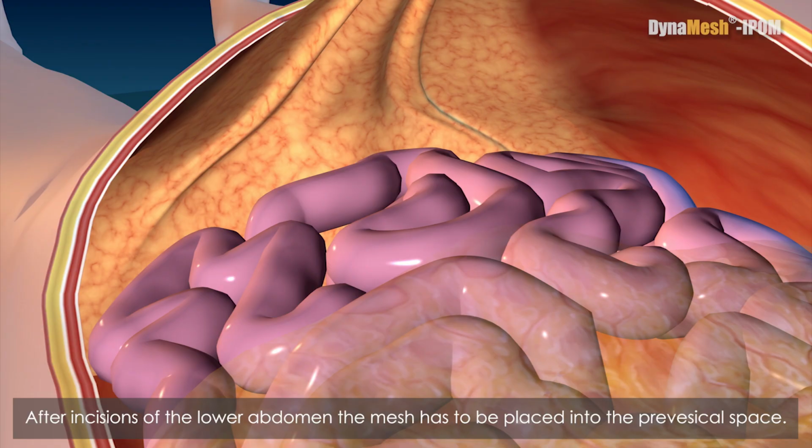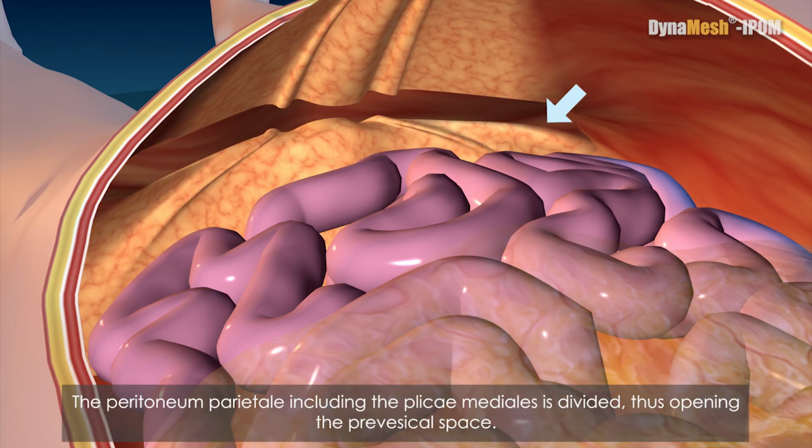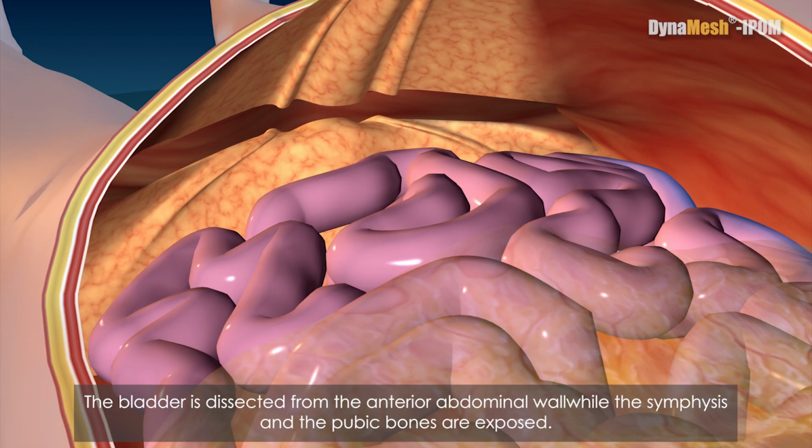After incisions of the lower abdomen, the mesh has to be placed into the prevesical space. The peritoneum parietale, including the plicae medialis, is divided, thus opening the prevesical space. The bladder is dissected from the anterior abdominal wall, while the symphysis and the pubic bones are exposed.